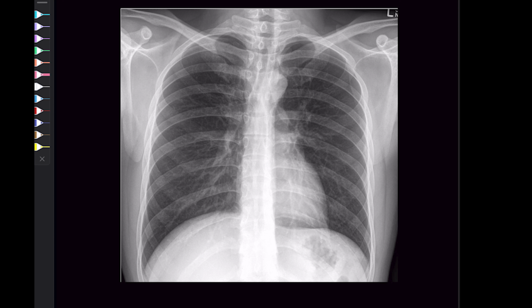Remember, when you're approaching any X-ray, we should not forget this single line. You only see what you look for, and you only look for what you know. That's why it's really important, when you are about to comment on any given X-ray, that you have a brief history of that person. So when you start approaching any X-ray, there are certain points which need to be very clear.